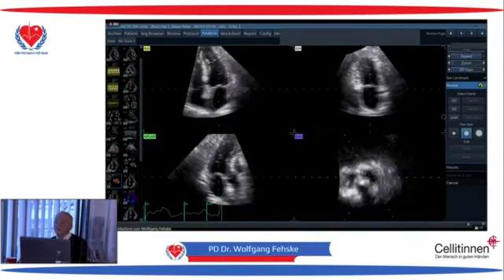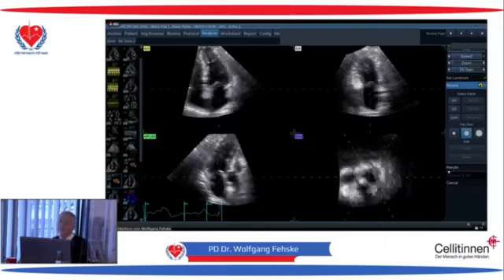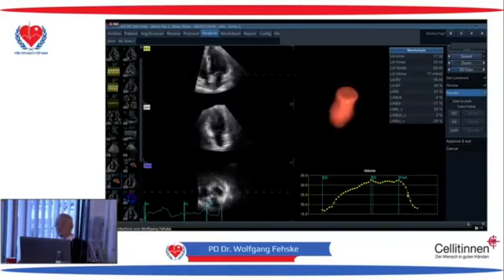I think it's really fine. And this gives exactly what we have seen before. I think it's really fantastic.